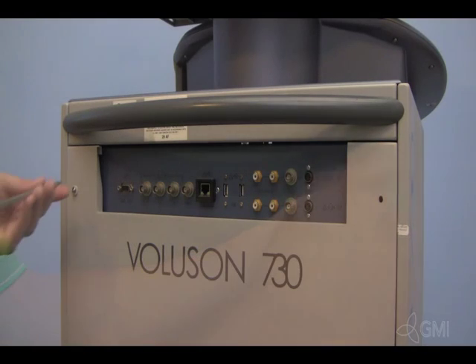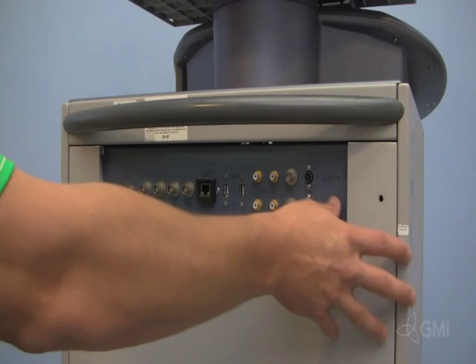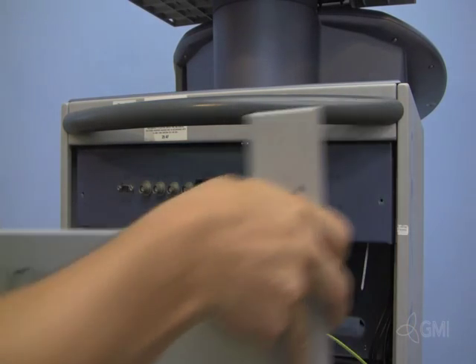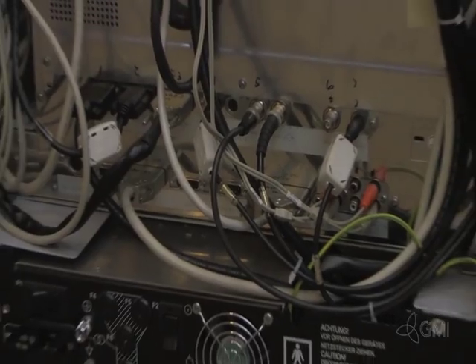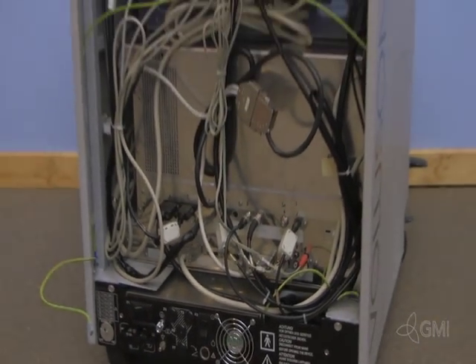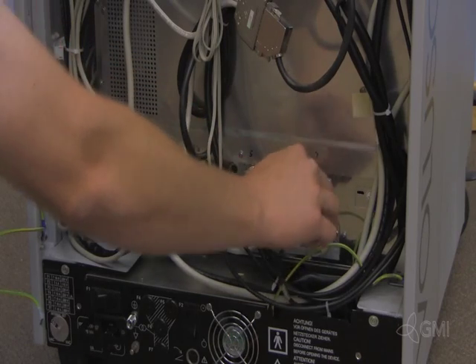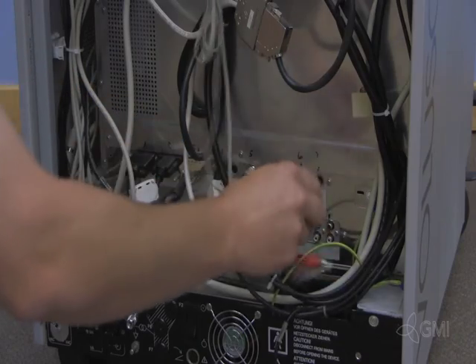Start with the system off and unplugged. Remove the two screws securing the rear panel. Remove the rear cover by leaning out from the top and lifting up. Disconnect the ground cable from the rear panel. Remove all cables, taking note of the cable locations and numbers if needed.